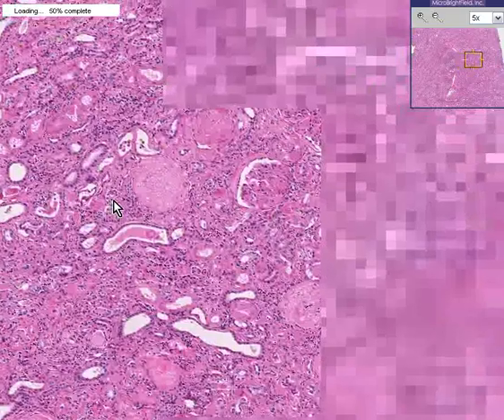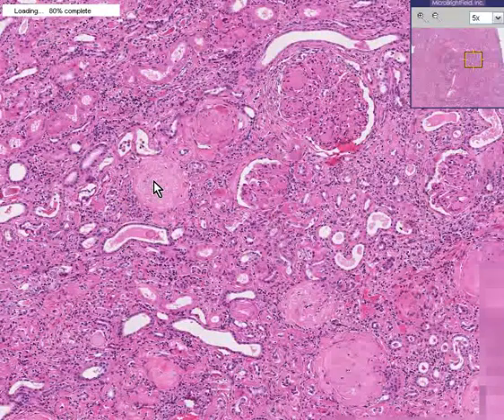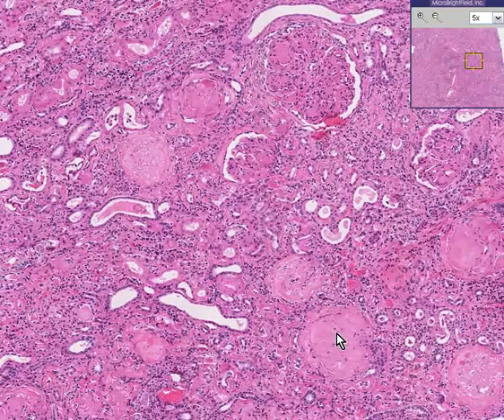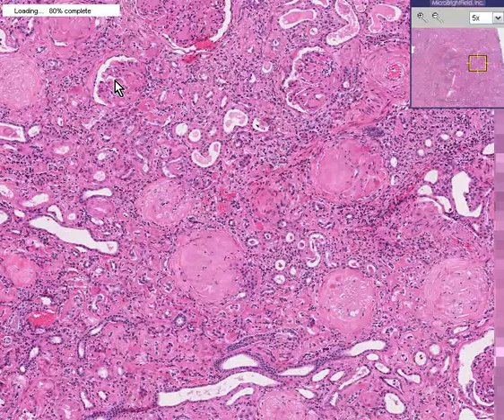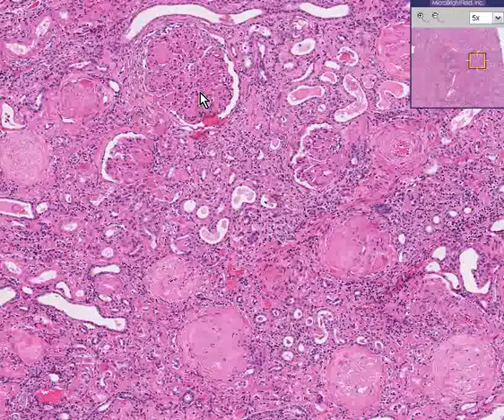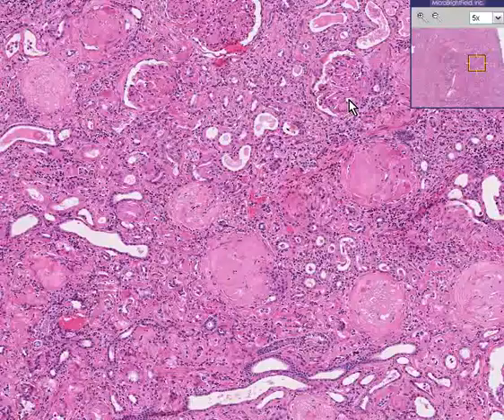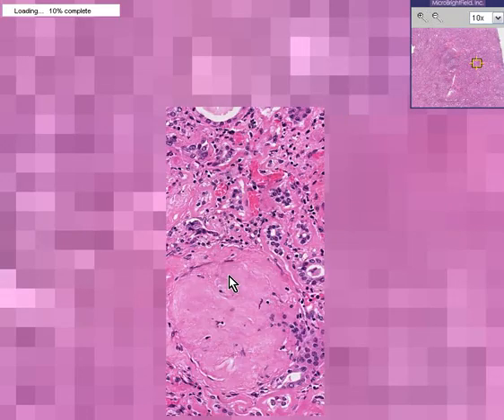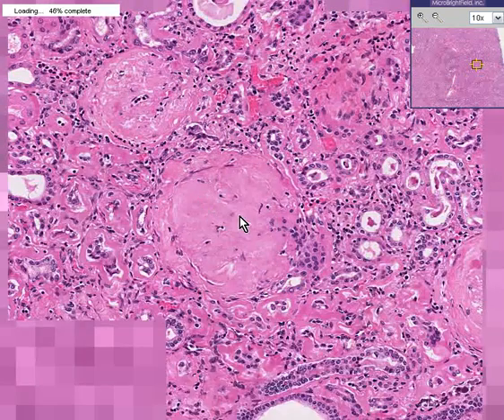The main feature is that many, if not most, of the glomeruli are hyalineized. The nice capillary tuft patterns that you can see in a few areas are basically virtually entirely replaced by just scar tissue.